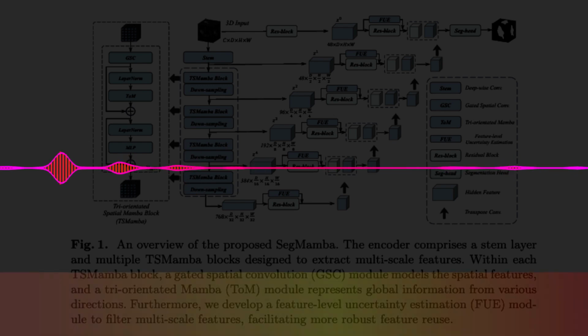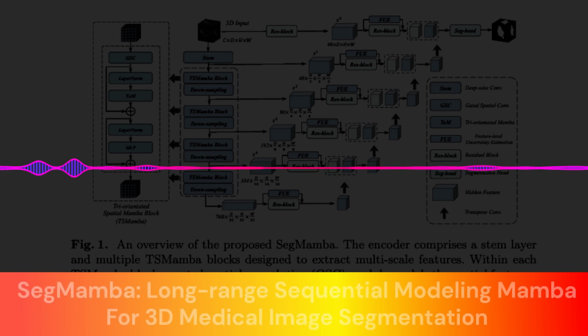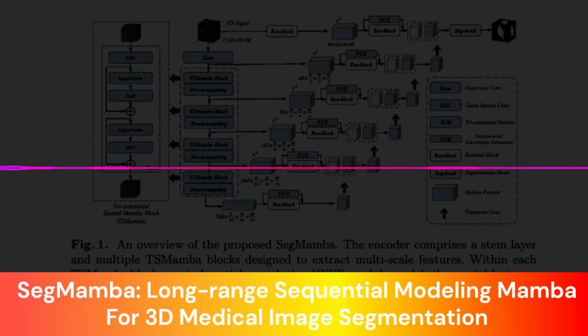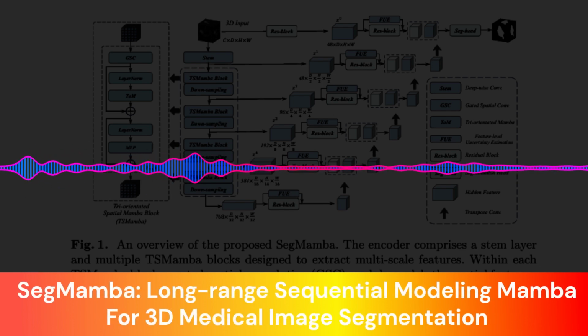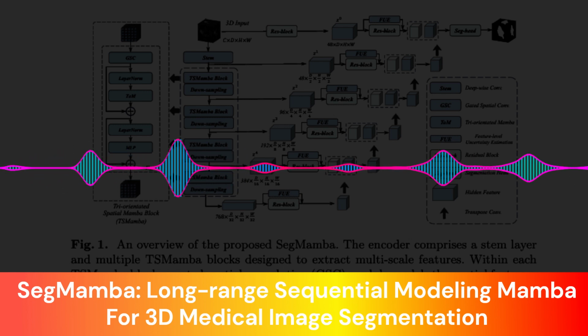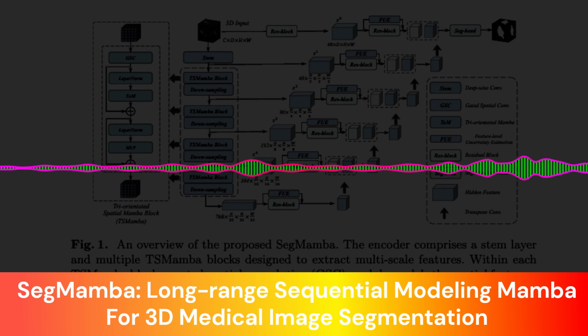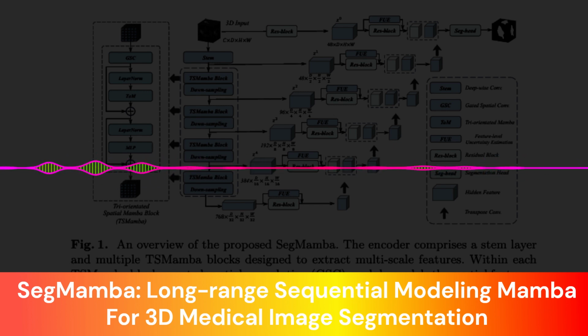It's a way to make better use of those skip connections, preventing noisy or uncertain early features from messing up the final prediction too much, like the model double-checking its own work. A kind of internal quality control on the features. Clever. And then, after all this encoding and uncertainty weighting, there's a decoder. Yes, the decoder part takes all these rich processed features from the encoder and uses more standard convolution layers to actually build the final 3D segmentation map, the outlines of the structures we want.